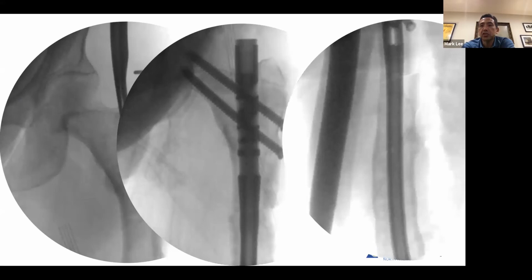Despite your really nice insertion angle, you got a little bit of varus there, Rafi. Yeah. The one thing I would say is that it's hard to control that short segment. I definitely use a lot of distractor in this setting with an off-axis pin to hold the reduction. The other thing we learned from Aker, a little trick for those atypicals, you could also do some eccentric lateral reaming by deflecting the guide wire in that proximal segment.